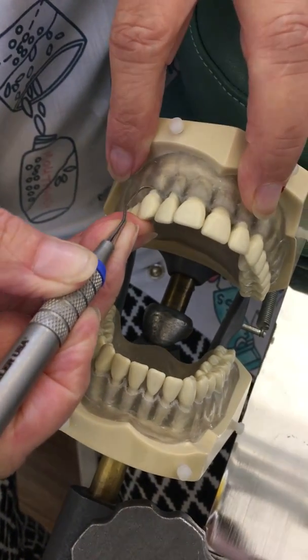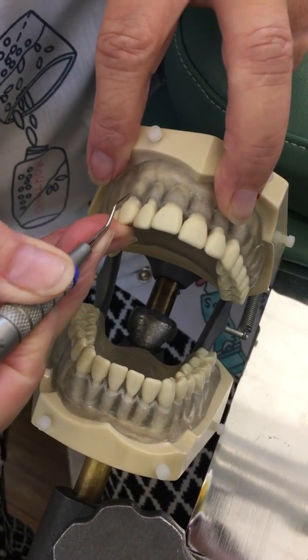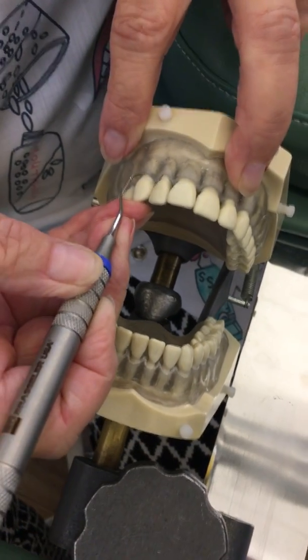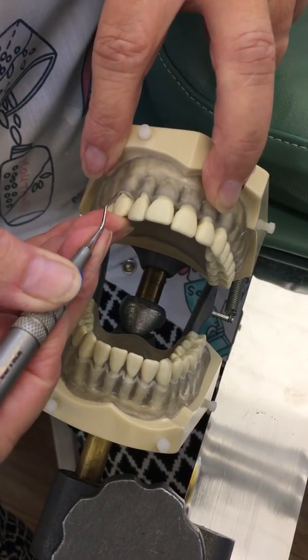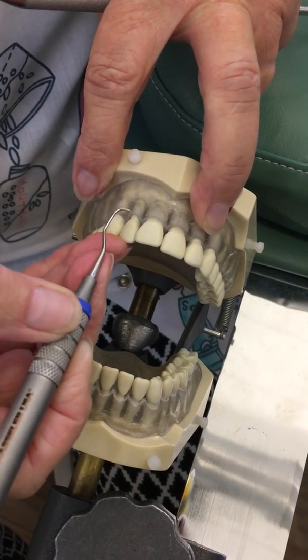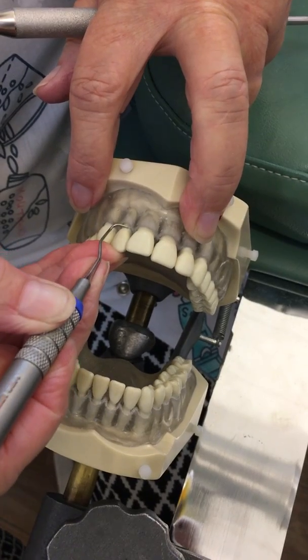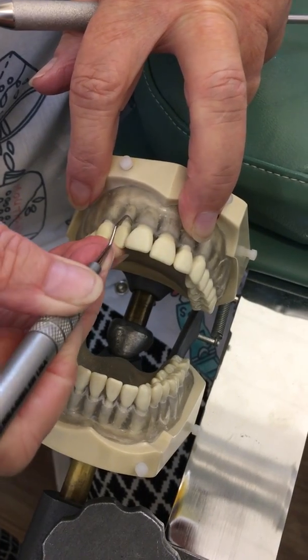I'm going to apply lateral pressure on my coronal stroke but not my apical stroke, and work the instrument around the tooth. I started a little on the other side of the midline, and each stroke was continuous — rolling that toe toward the tooth, toe to tooth, toe to tooth. Then I pick my fulcrum up and go to the next tooth, keeping all three fingers together, closed and open, maintaining that toe on the tooth.